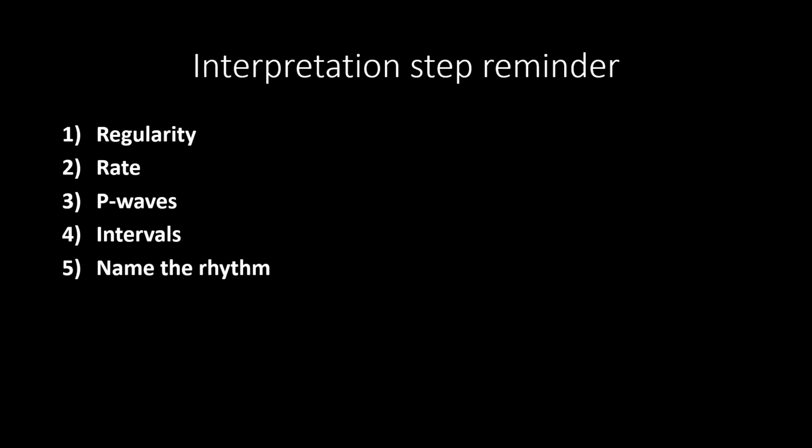So these are just reminders. I've said quite a few times that you should follow whatever your school's teaching you or whatever your book says, and you should. It's just this is the way that we learned it in these crash courses, these steps right here, and that's the way that I'm going to go through them in this video. But if you have a different way of doing it, that's fine, just as long as you get the same information from looking at it as I will go over. That's fine. But this is just a quick reminder. Write these down if you need to, if you haven't memorized them, which you should have, because this is what we're looking for.